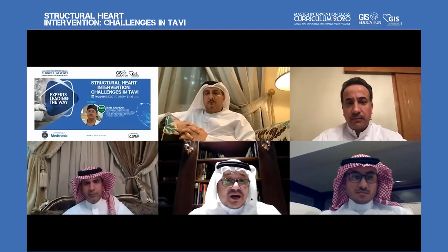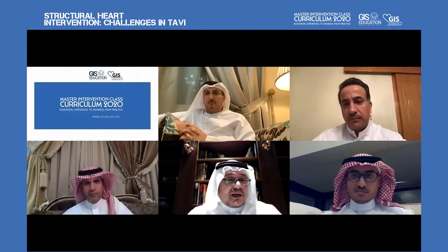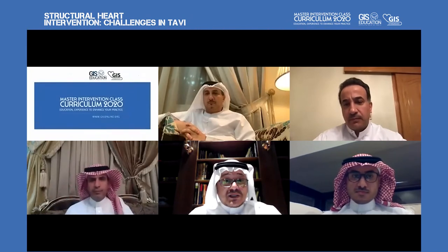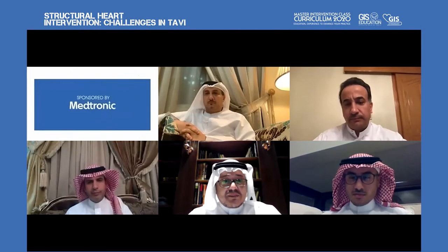Regarding the carotid approach, a lot of people are so excited about it. The data we have shows good outcomes, but none of the studies is powered for stroke. Is it increasing the rate of stroke? Is the number of patients included in studies enough to tell us about stroke in this approach? I think it's a big concern.